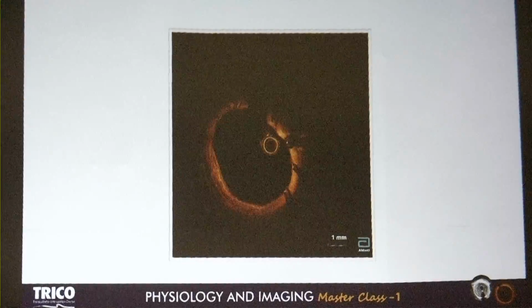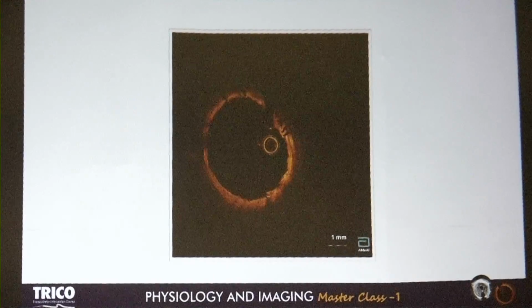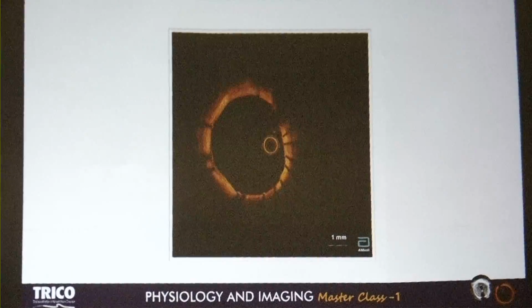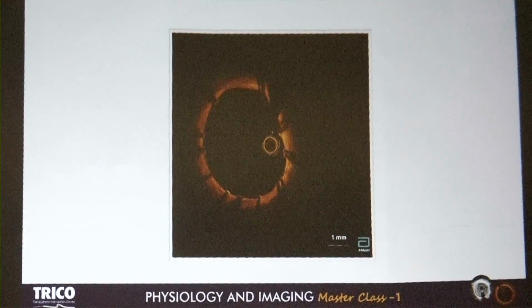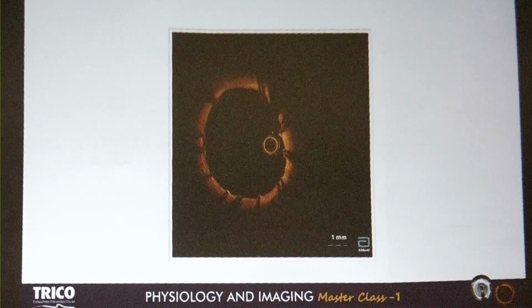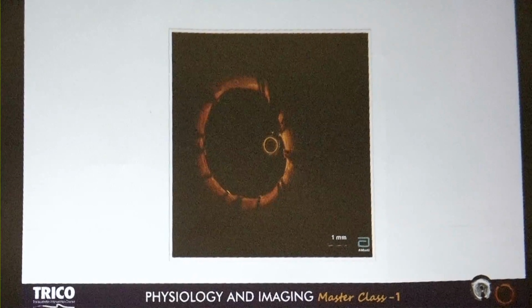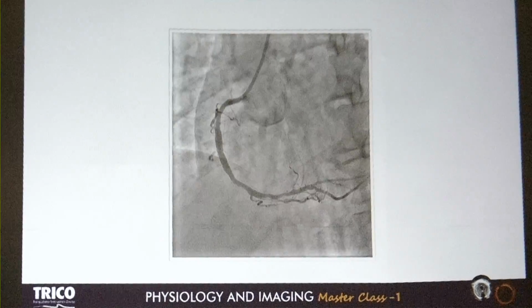We had published 10 cases data about this recanalized thrombus in the Journal of Cardiovascular Medicine, and we were so comfortable with using the hydrophilic wire, and my choice of wire was Choice PT with the balloon support. As there are multiple channels, sometimes it's difficult to cross the lesion, and balloon support or microcatheter support do help in crossing it. Okay. So this is the result.